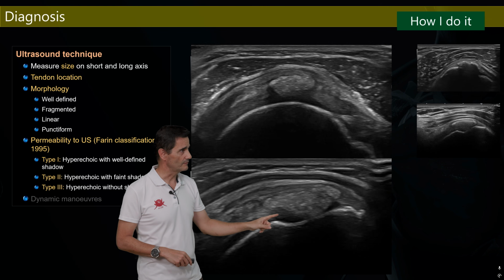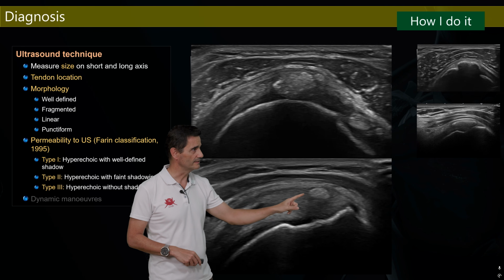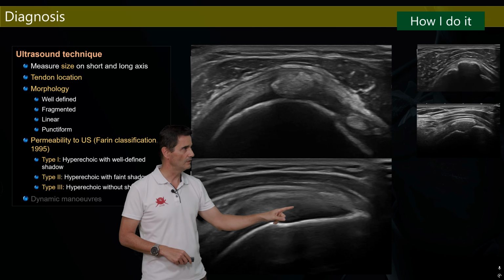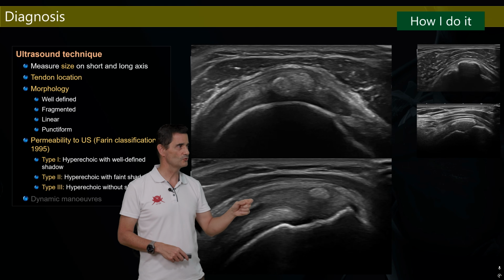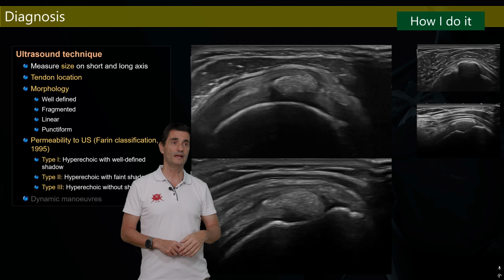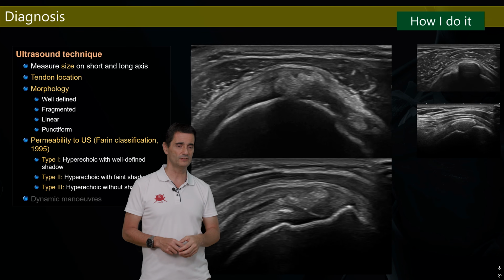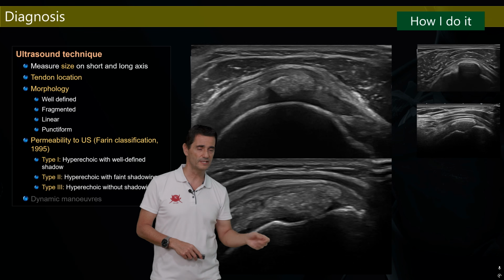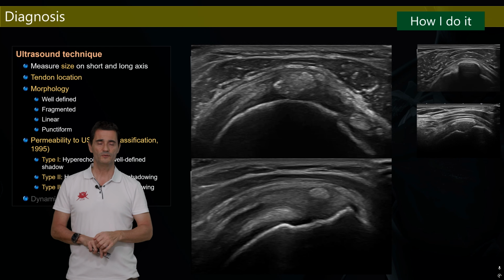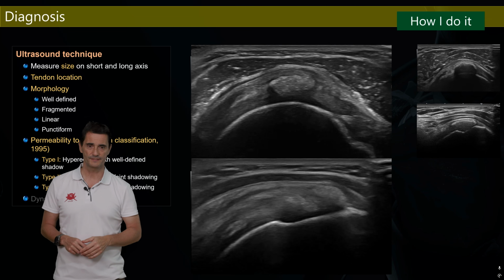And in this case, for example, this calcification is just about to break into the bursa. So if you find a patient with this type of calcification, this type 3, just try to remove this calcification before it breaks, because you will reach a better treatment, better quality of life for the patient. And if this calcification breaks, the patient is going to have bad times, 10 days, 14 days. Okay, so maybe you can relieve this before it happens.